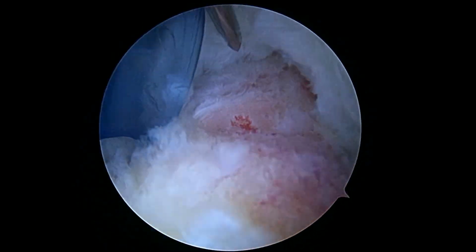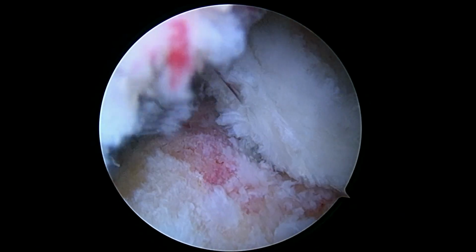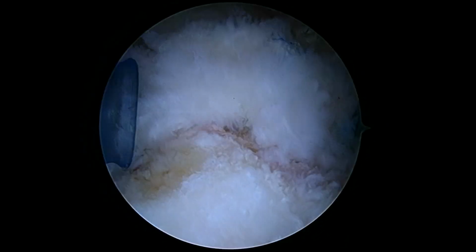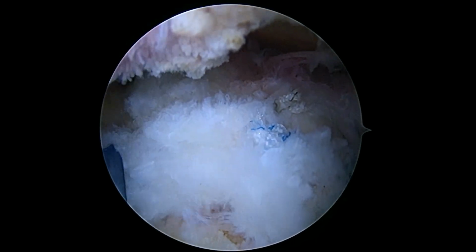I think this is going to be a better angle here. If we get our anchor down right about here, that ought to be pretty good. 2mm punch. Okay, we're done. We've tied 9 sutures for the cuff and a suture for the biceps.